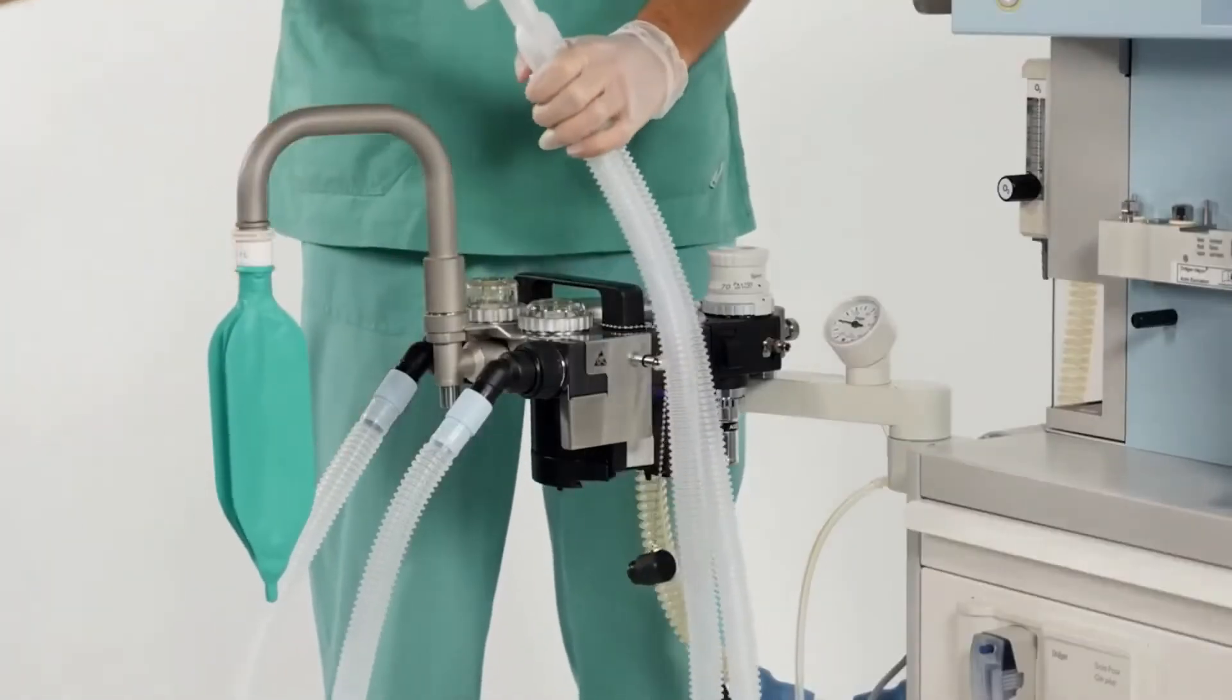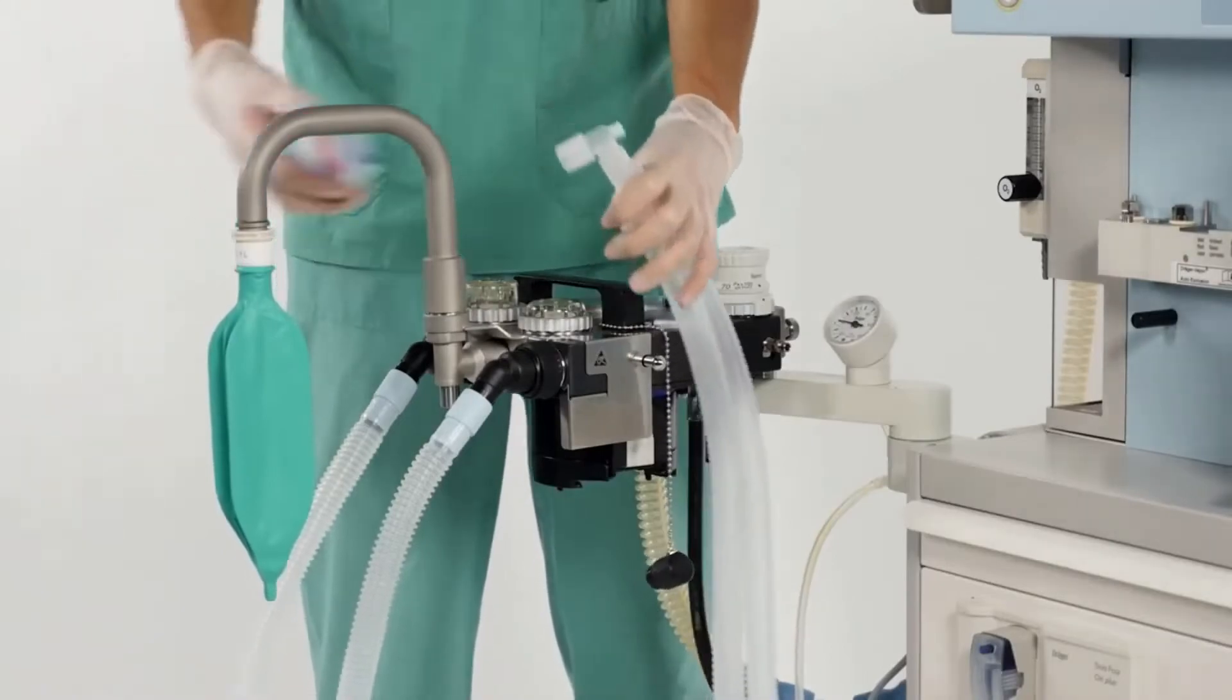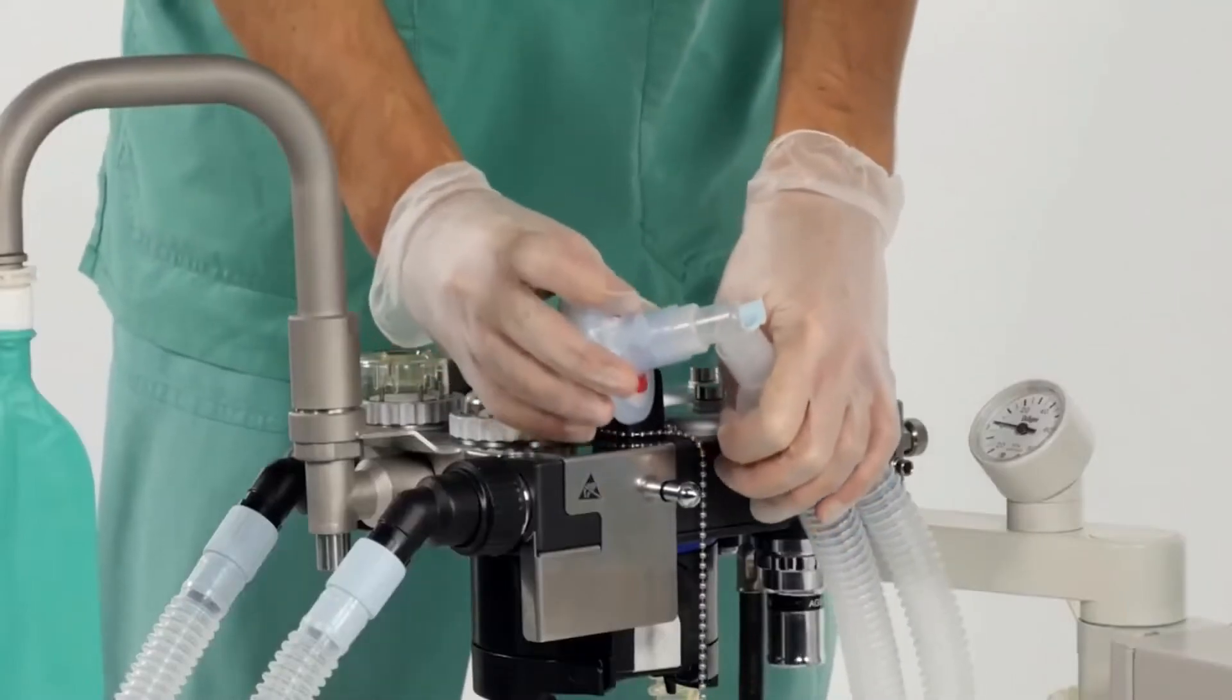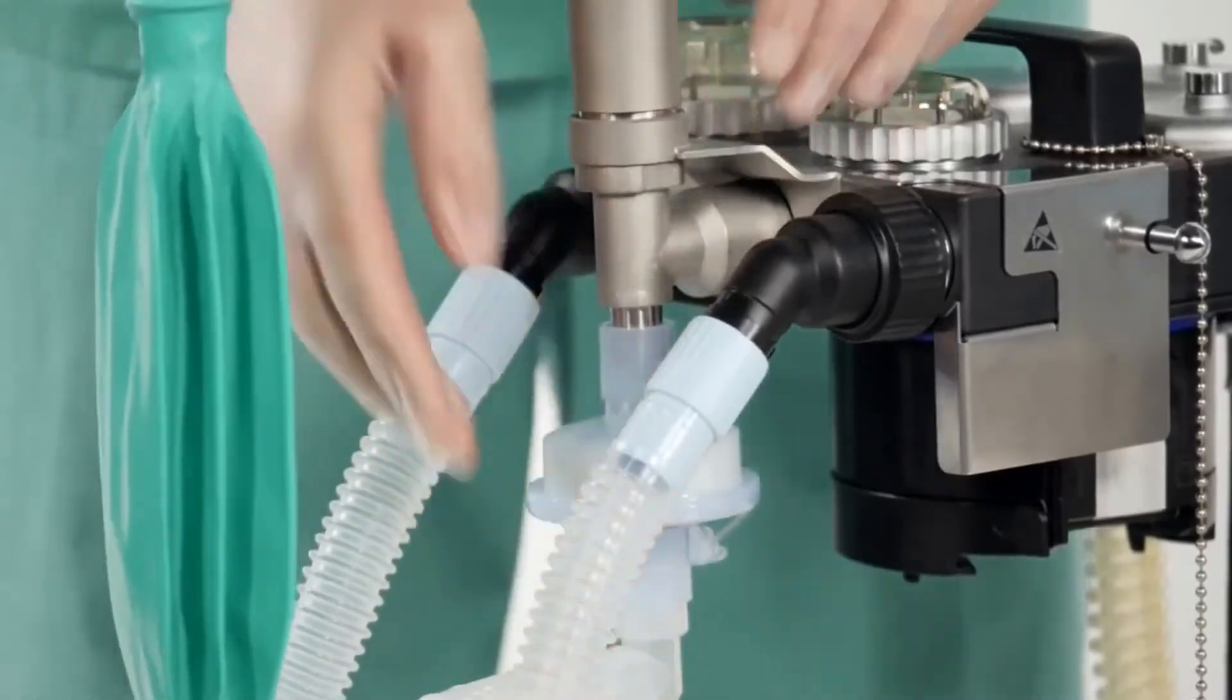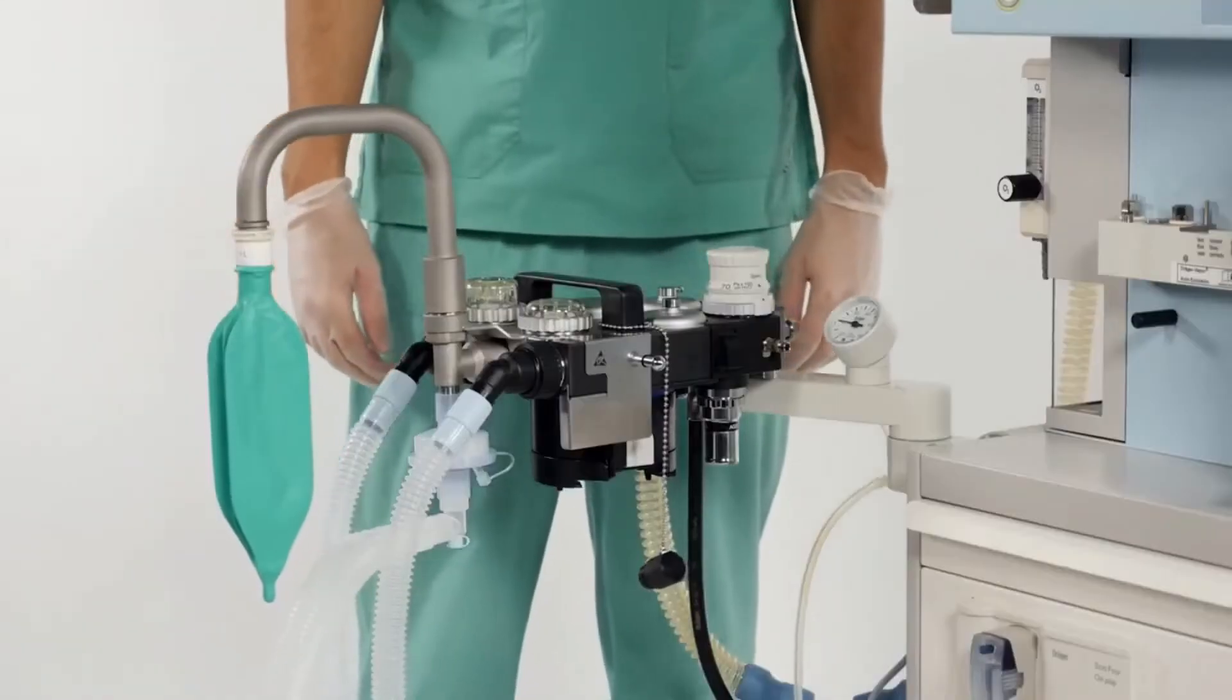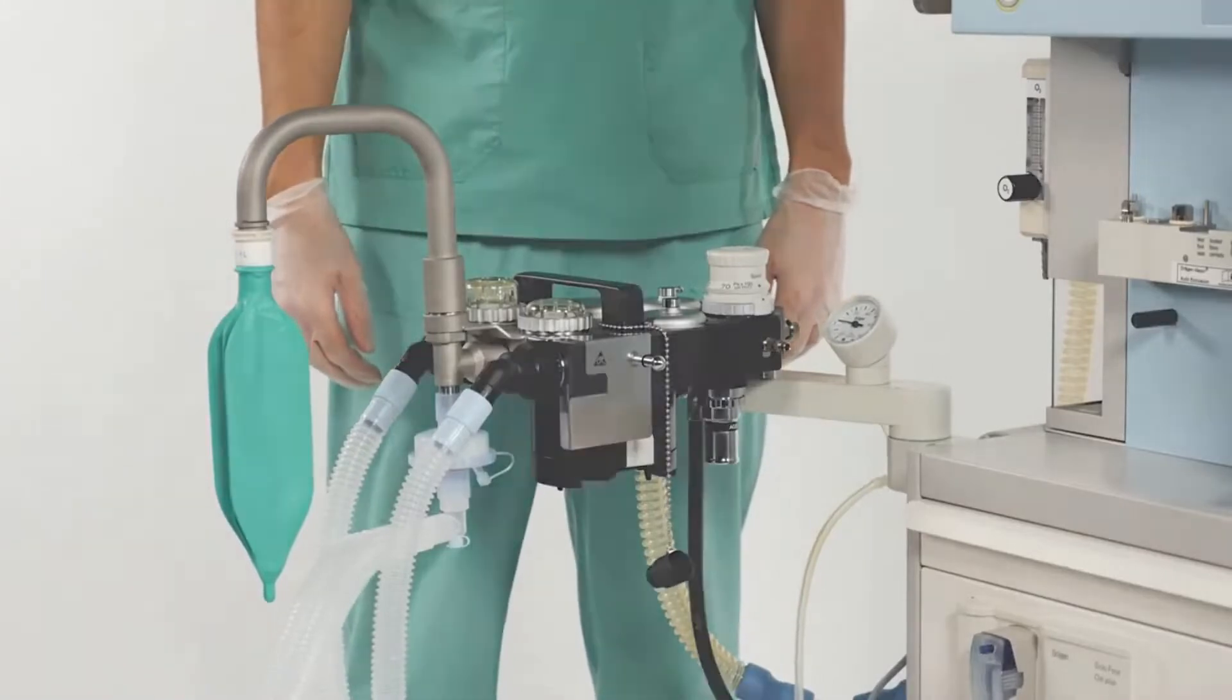All filters that will be used during operation should be installed as well, in order to include them into the self-test. In this case, we will use a filter on the Y-piece for demonstration. Place the filter on the park position on the bag port of the COSY.